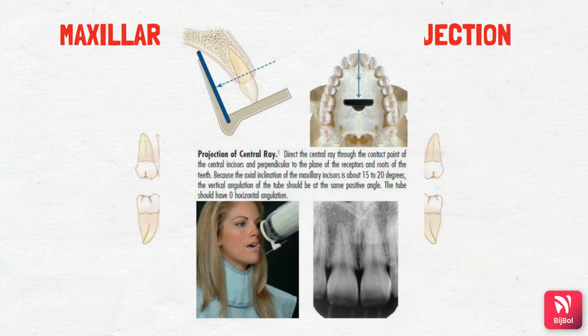Point of entry. Direct the point of entry of the central ray high on the lip in the midline just below the septum of the nostril.